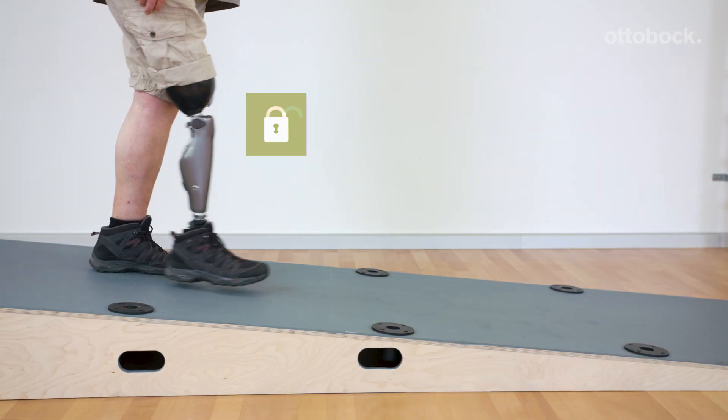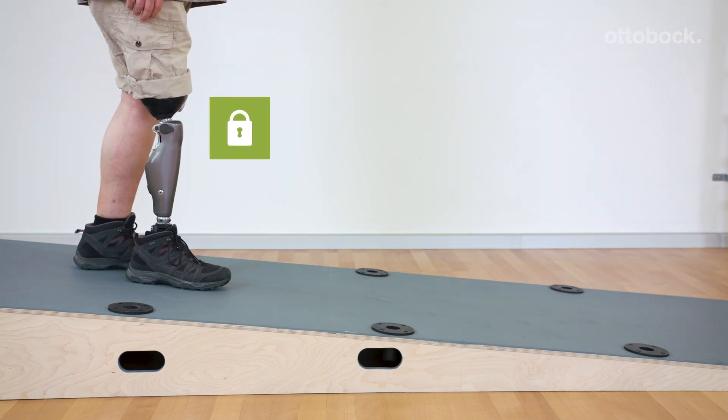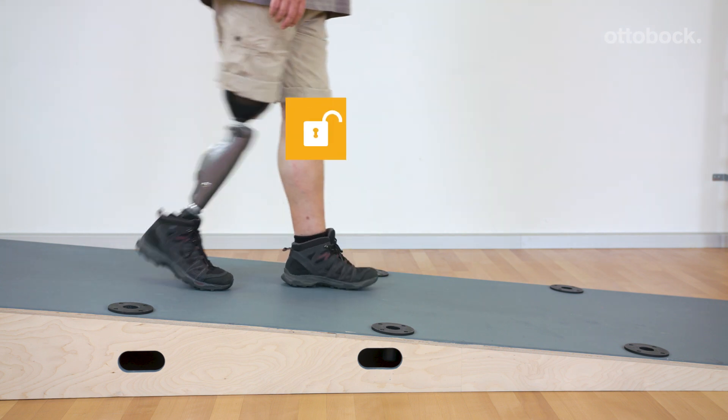Unloading the prosthesis is also practiced, followed by knee extension with stance release.